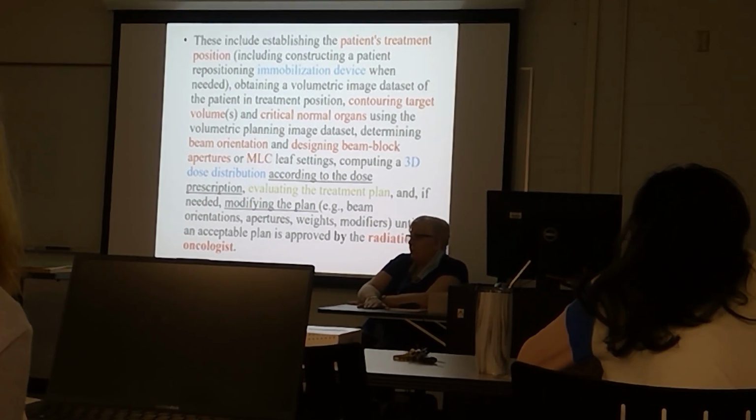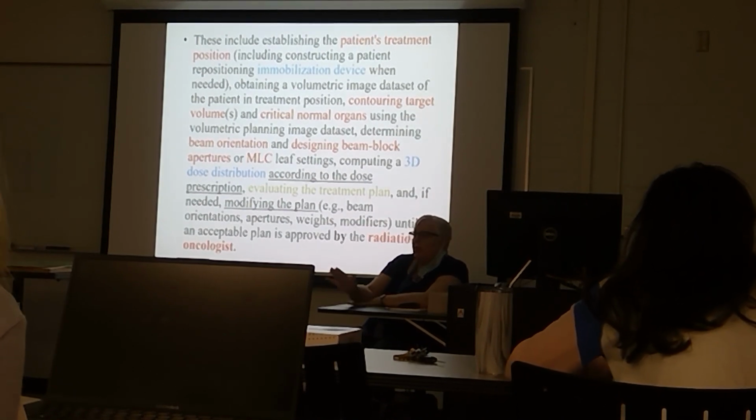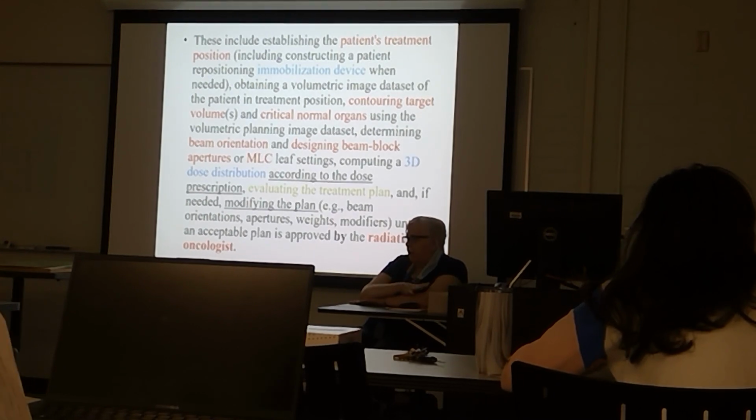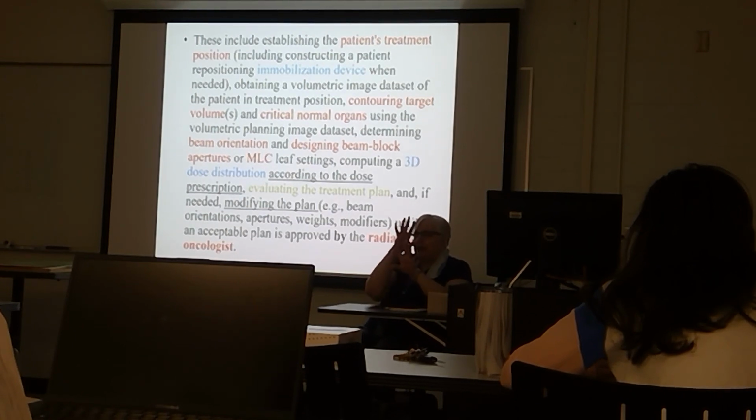That's what it's meant for. Don't even go near the KV beam. Don't even go near the bony anatomy. It will be off. 99% of the time, you can't match soft tissue and expect the bones to be in the same place.